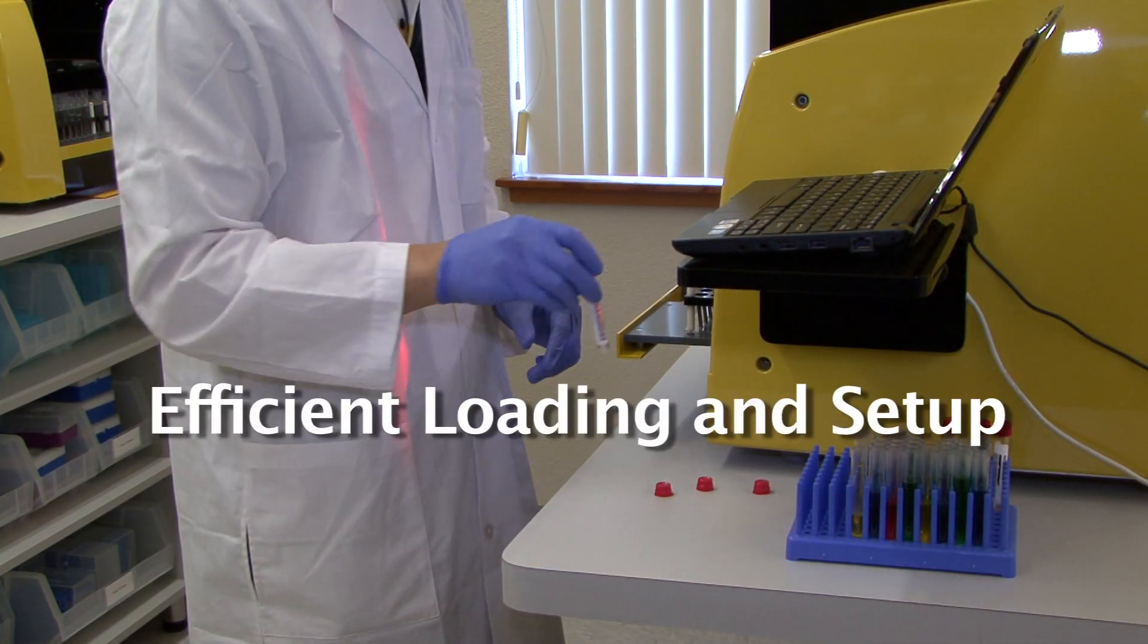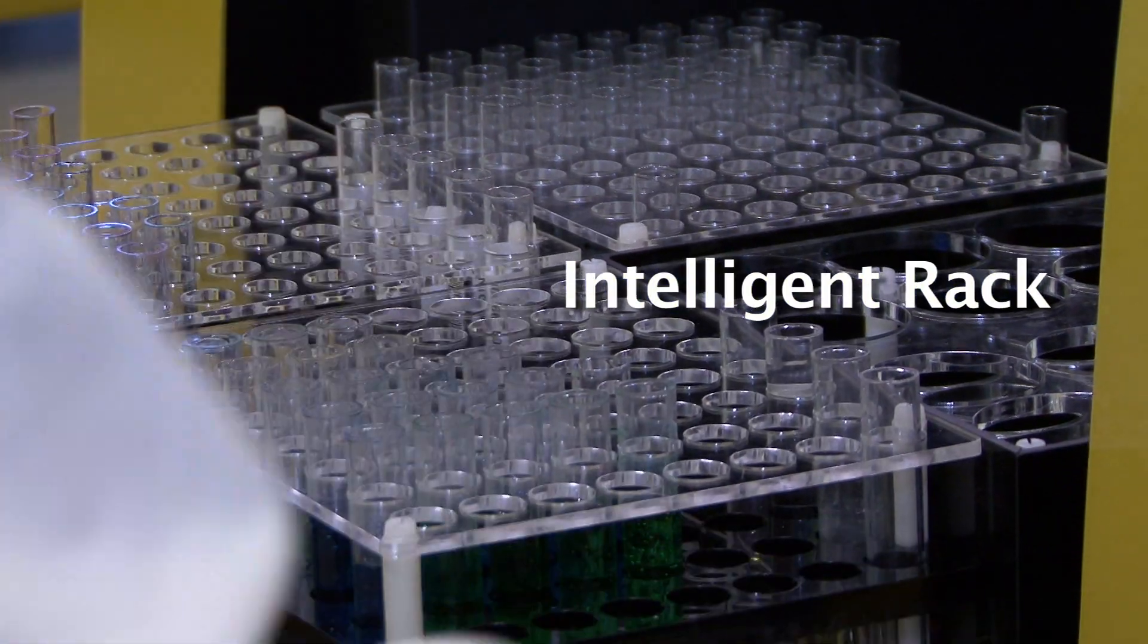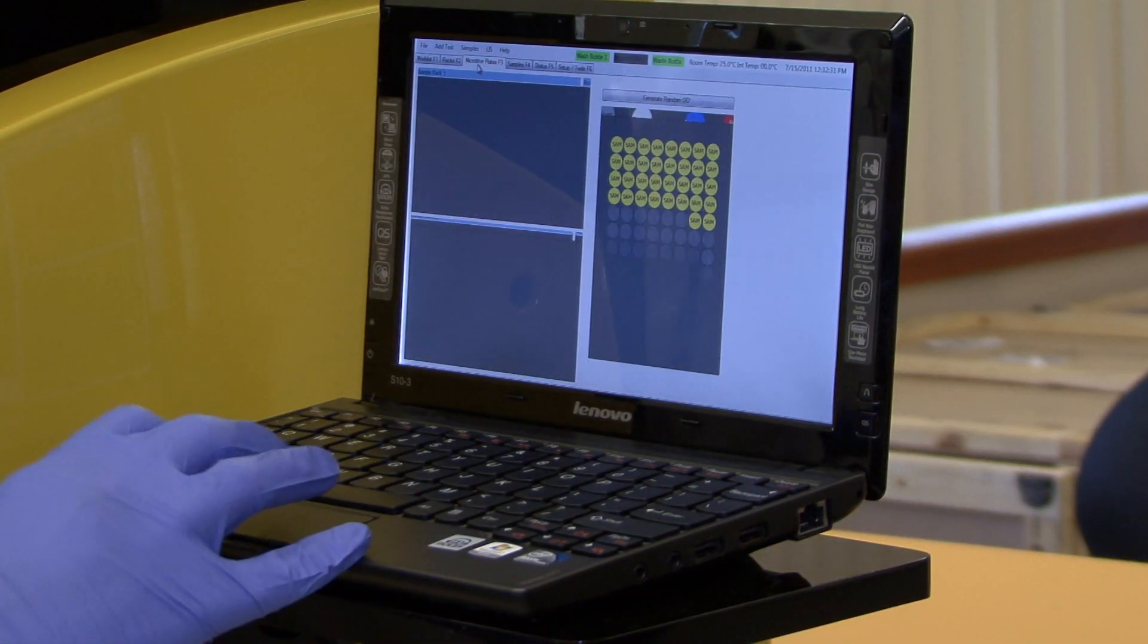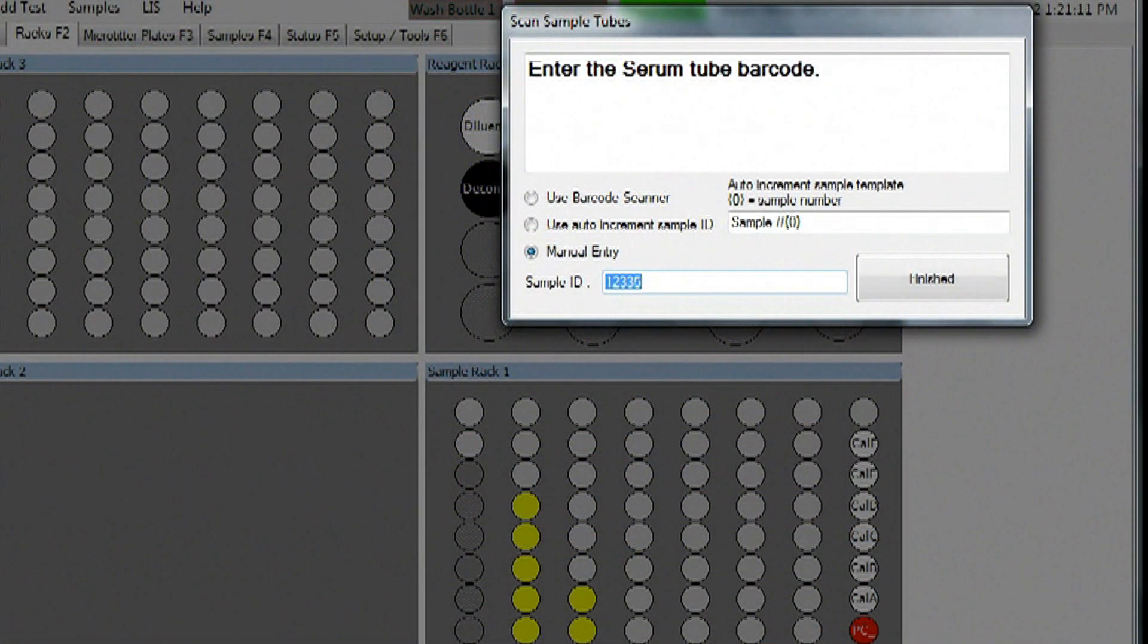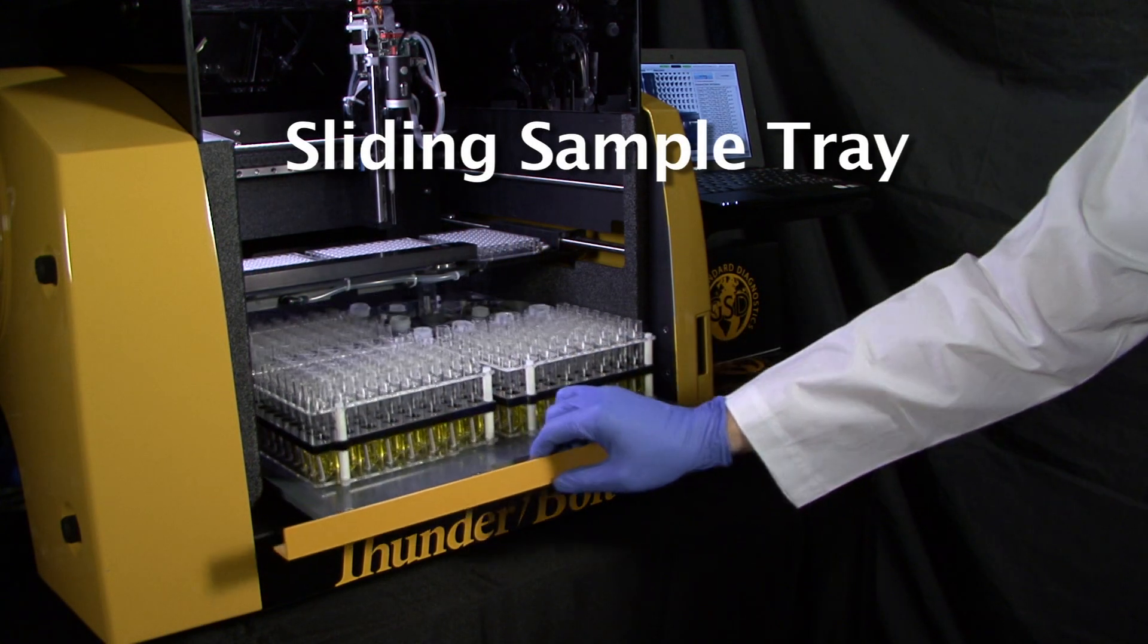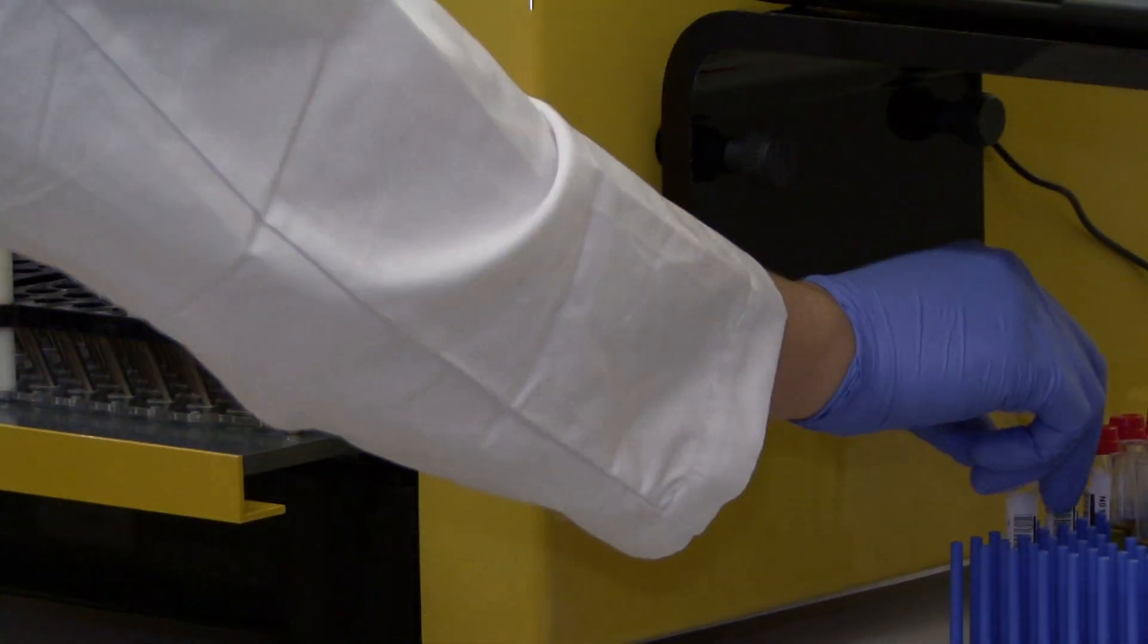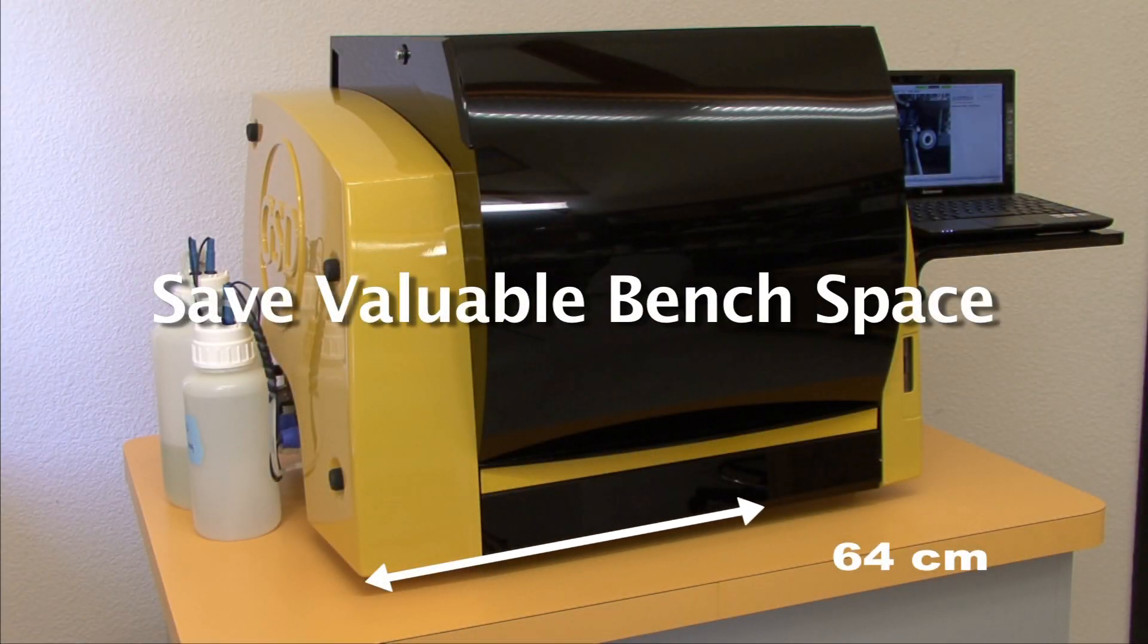The Thunderbolt offers efficient loading and setup. Patented intelligent rack technology knows where a test tube has been loaded, and the software records the location. Combined with the built-in barcode reader and the sliding sample tray, the Thunderbolt streamlines setup while decreasing errors.